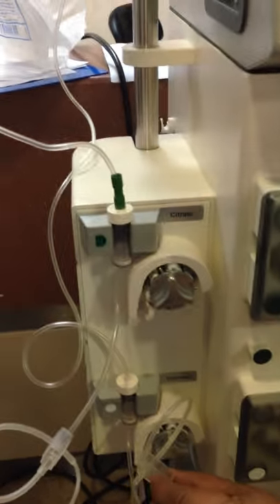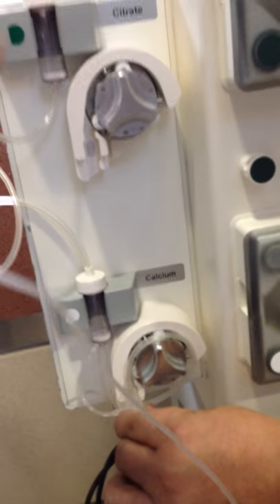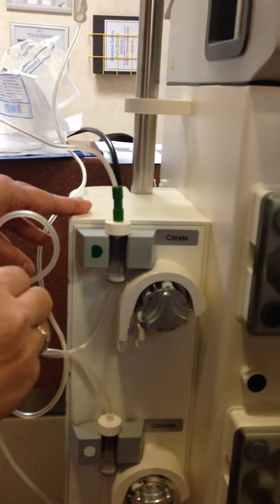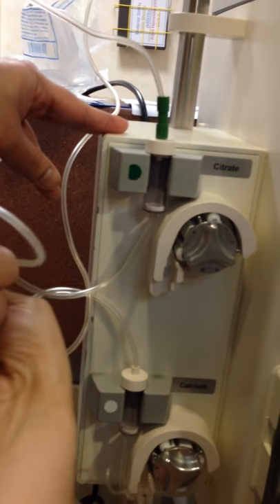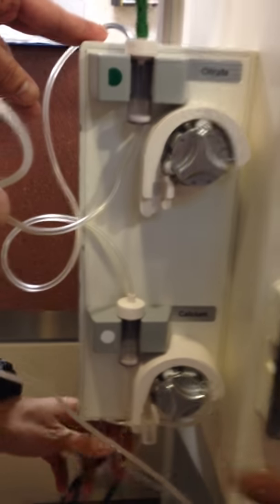When you do this, pinch. Let me try. Can I pinch? Pinch the nose. Push, slide. Okay, so then you will just slide. Automatic. Now, see what is being done in there now. Why is that stopping? No, it will just leave it. What it's doing right now is creating a negative pressure.